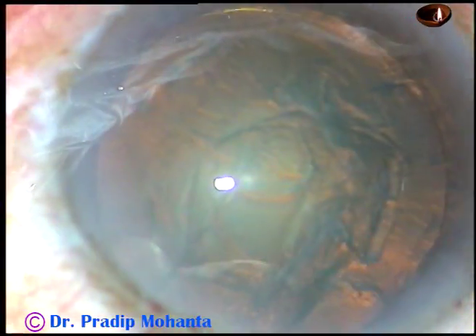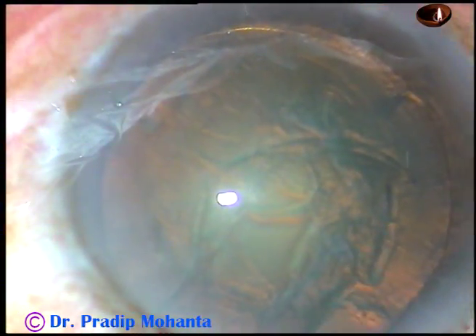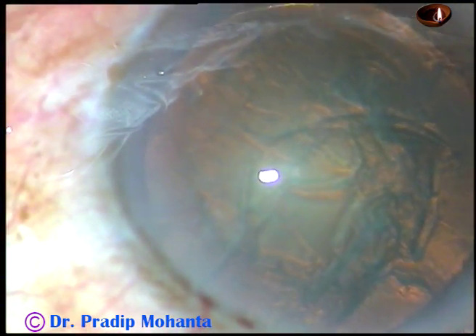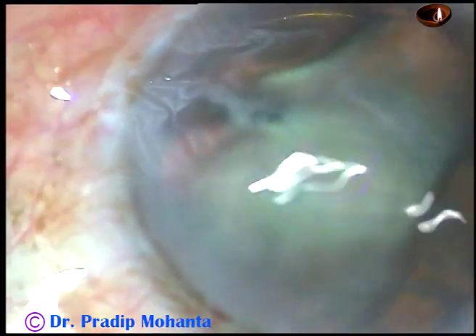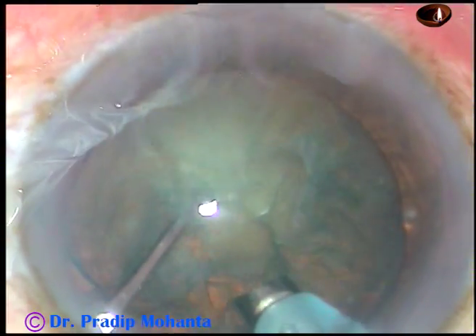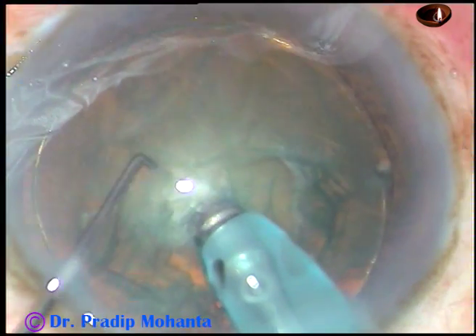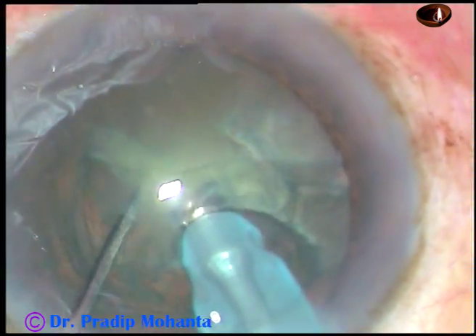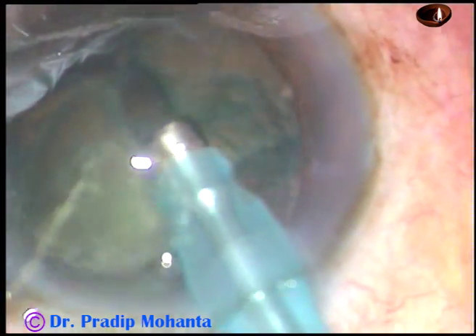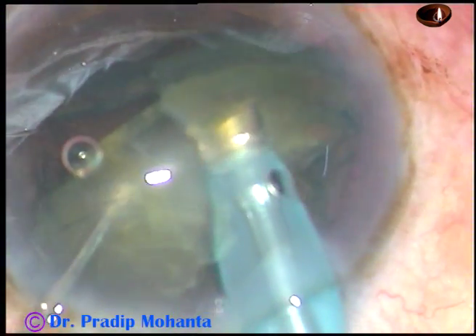Visco is again injected. Now is the time to introduce the handpiece. This is a totally unedited surgery. The machine being used is the Oertli CataRhex 3. The tip is buried into the substance of the nucleus and the nucleus is chopped. Here I folded it at the middle and cut it into two halves.